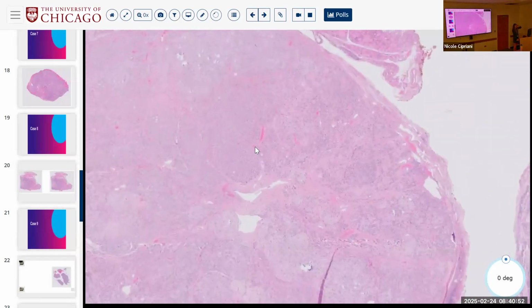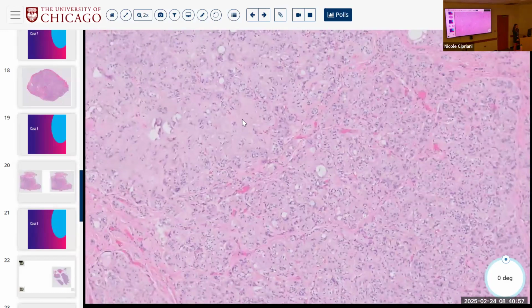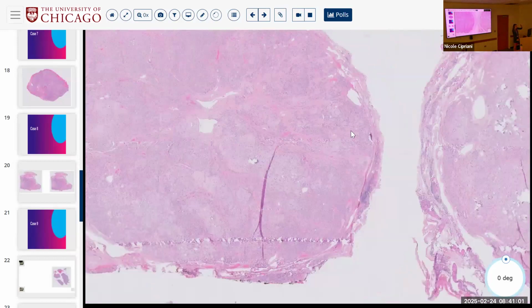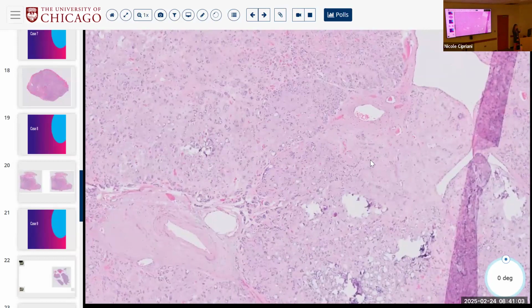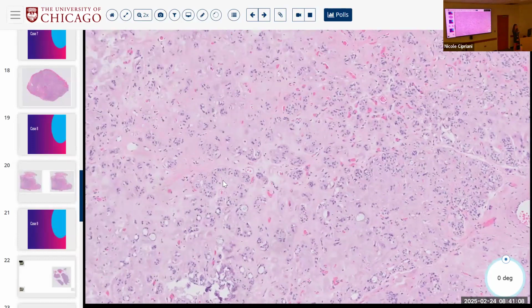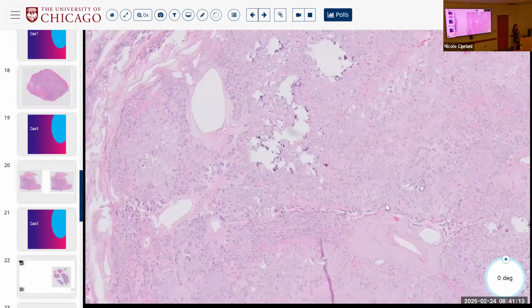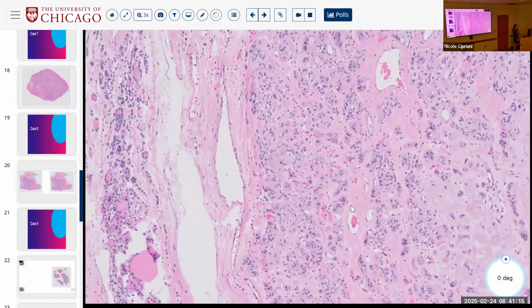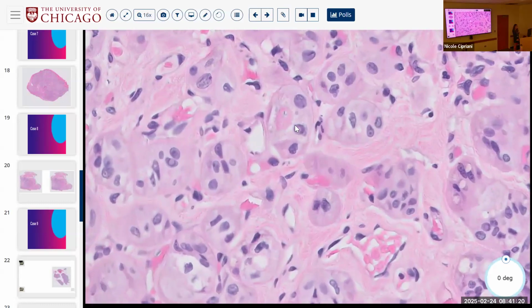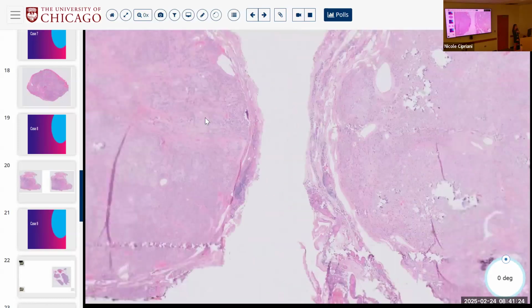Who knows what the next tumor is? Hyalinizing trabecular tumor, right? So it's very circumscribed. It's got very rich stroma. It's got some maybe pseudofollicular spaces, but mostly it is these sort of trabecular cords, right? There's true intranuclear cytoplasmic pseudoinclusion. So study this on your own.